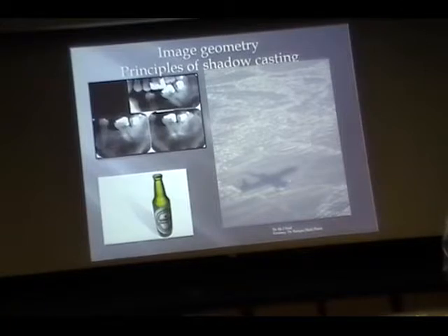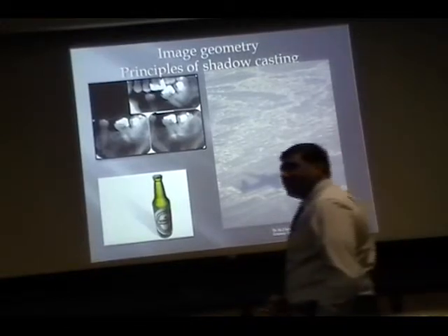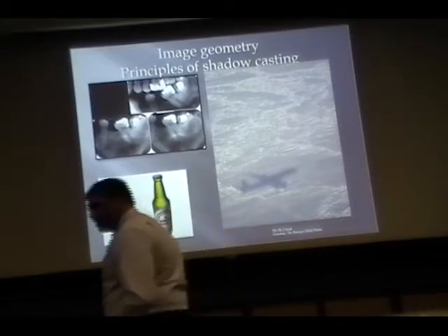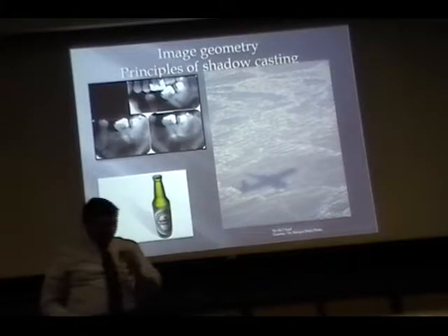Okay. So what is the basic difference between MRI T1 and T2? MRI is for soft tissue. Let's put it that way. So it's lighter, I think. So what do you use the terminology?